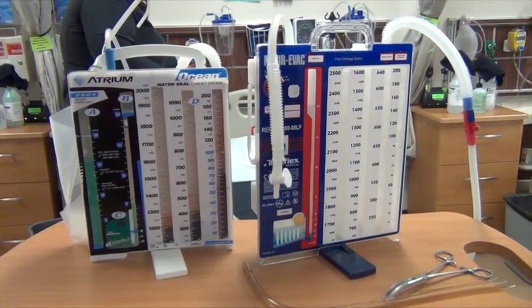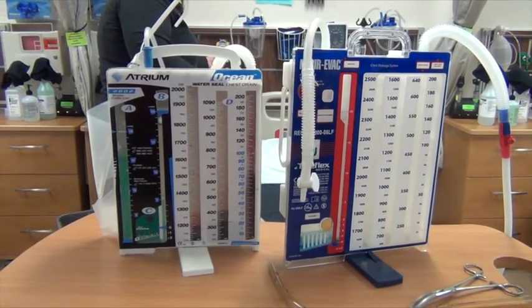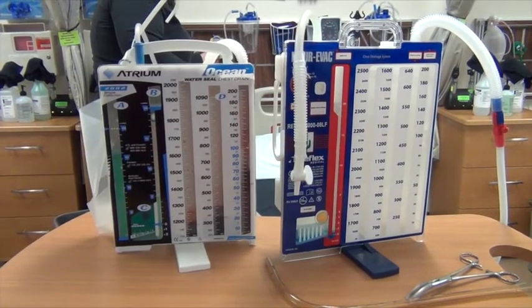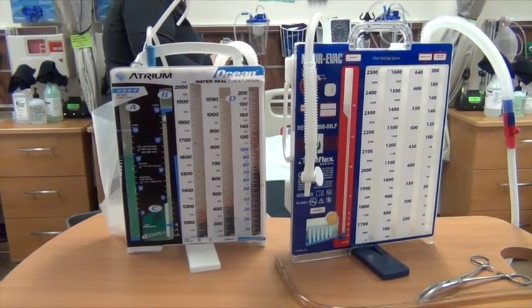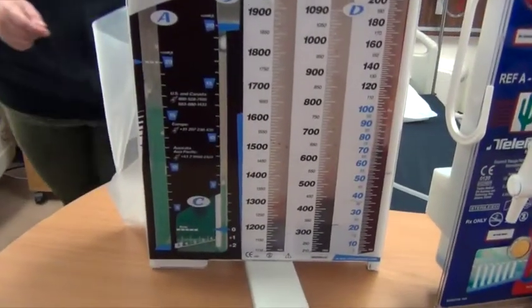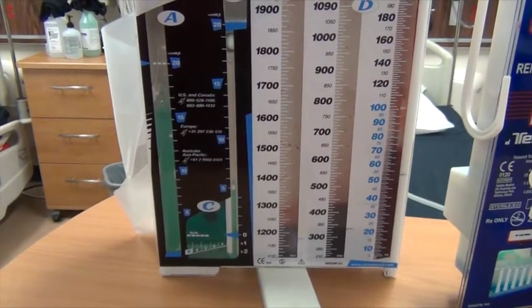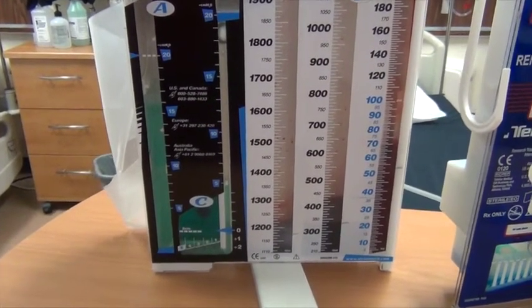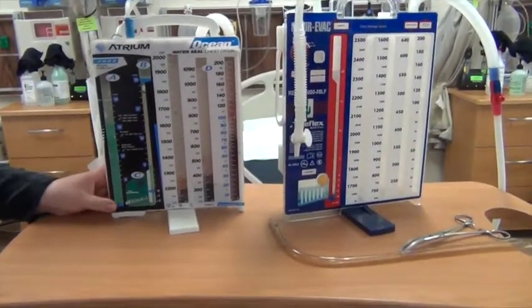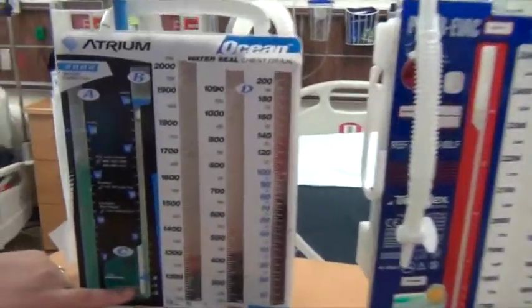Let's see if I can get it. There we go. Do you see how it's just intermittent, gentle bubbling? That's what we're shooting for. Okay? So that's suction. Next we'll go to the water seal chamber.